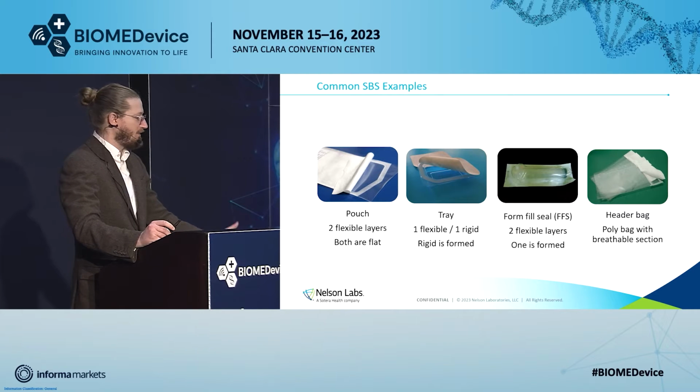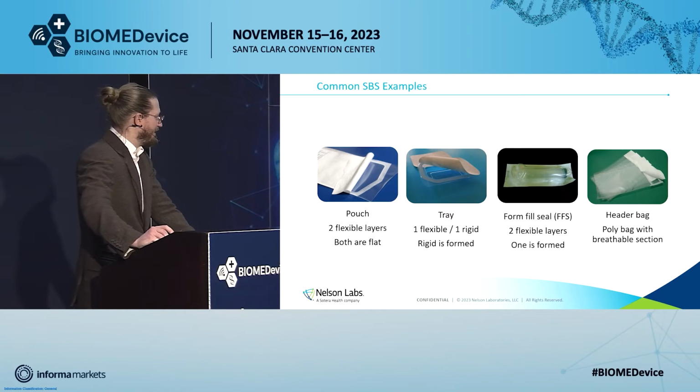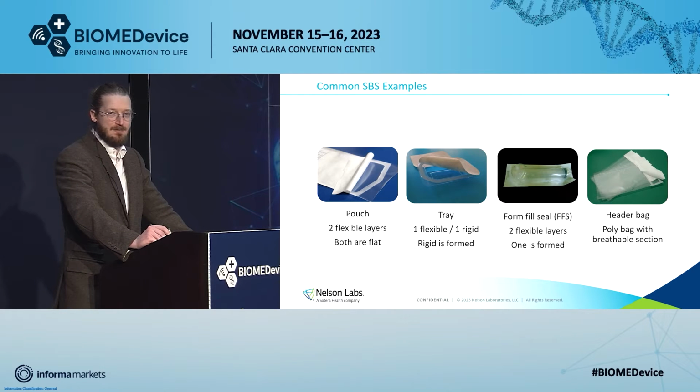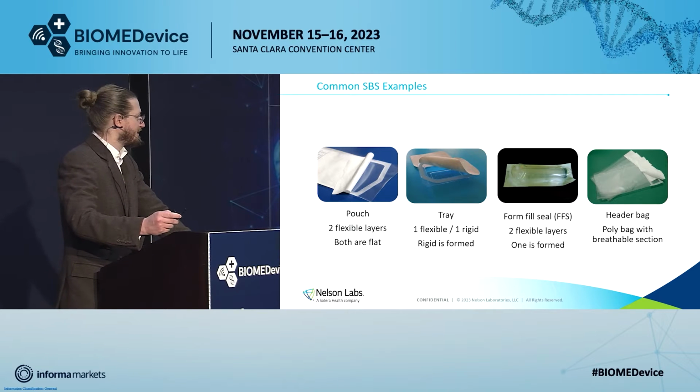So you're probably aware of a lot of these packaging designs. Pouches, trays, form, fill, seal, and header bags are kind of the bread and butter for what most medical devices are packaged in. You might have something unique that you don't see on here, but I would probably say that like 90% of all devices can be captured in one of these sterile barrier systems.